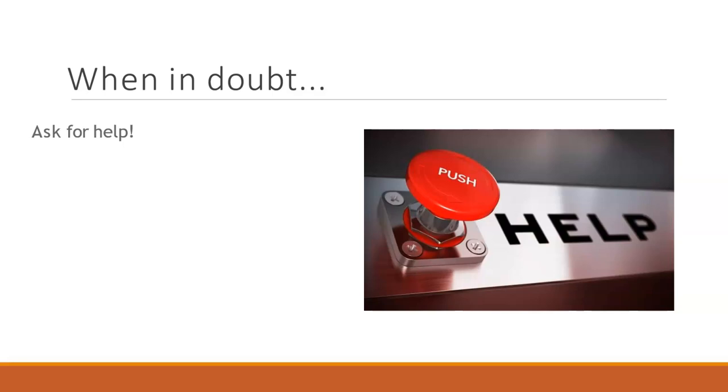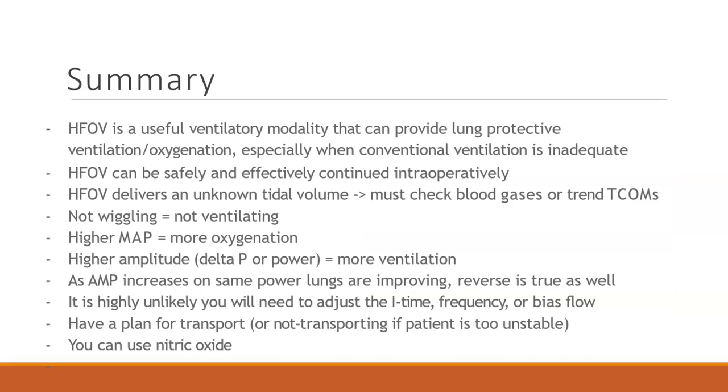Okay, this is a lot. When in doubt, ask. Ask for help. We are going to have lab after lab after lab. There's going to be resources, quick references, guides, and just ask for a second opinion. It is not crazy. It's not weird. This is a totally different way to ventilate than anything else that is used. We're talking hertz and amps, which are things, unless you're an electrician, we don't usually talk about. So we will always, always, always support anybody's questions.